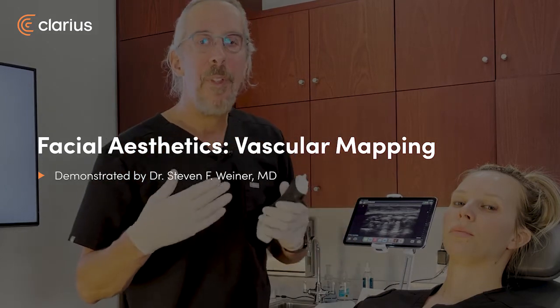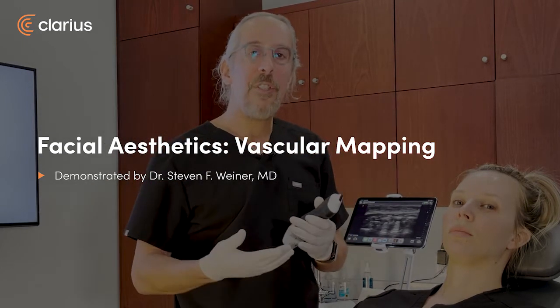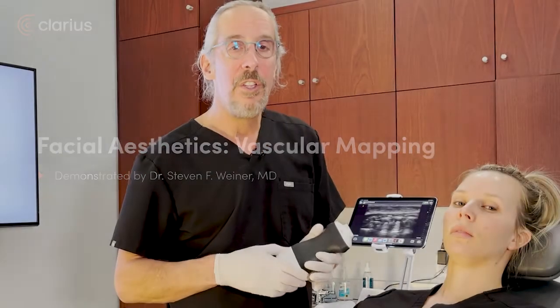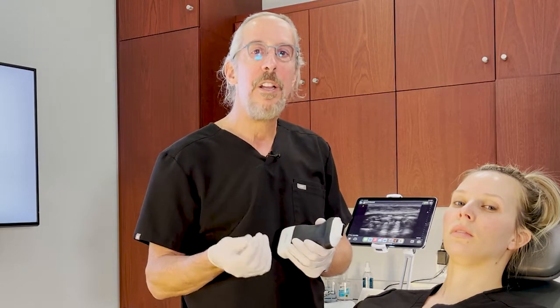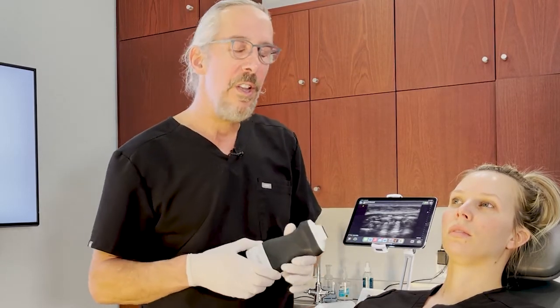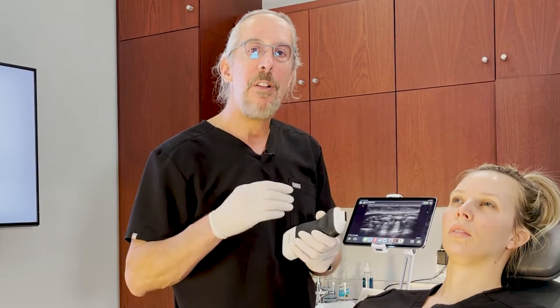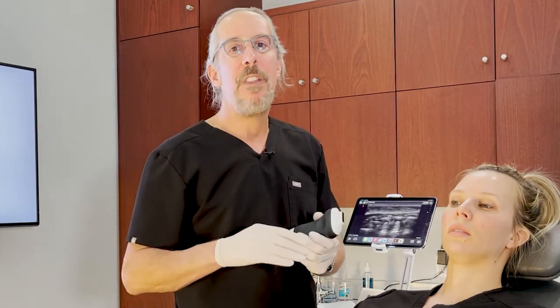As you know, if a vascular structure is injected, you have the risk of vascular occlusion or even blindness. So identifying where the vessels are and their depth is very important to prevent these complications. And so what I do prior to injecting patients is identify the main vascular structures in the area where I'm injecting and see what depth they are, so when I'm injecting, I can be either below or above the vascular structures that are critical in that area.